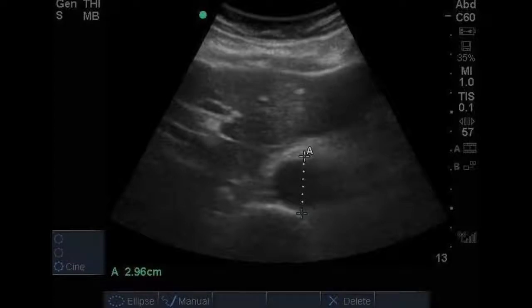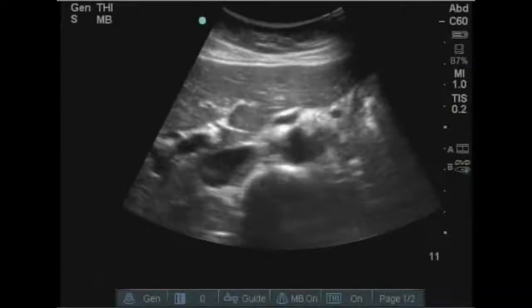I can see the abdominal aorta measured outer wall to outer wall, and I see mostly liver dominating my view. I do not see any evidence of the celiac axis or the SMA in view. If the celiac branches or the takeoff is in view, you are now in the mid-aorta. Here in this transverse view, I can see the celiac branches. That tells me I have gone distal to the takeoff of the celiac axis.